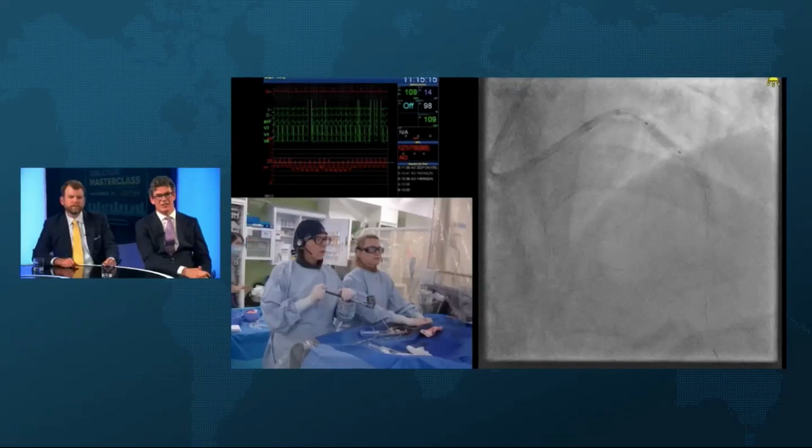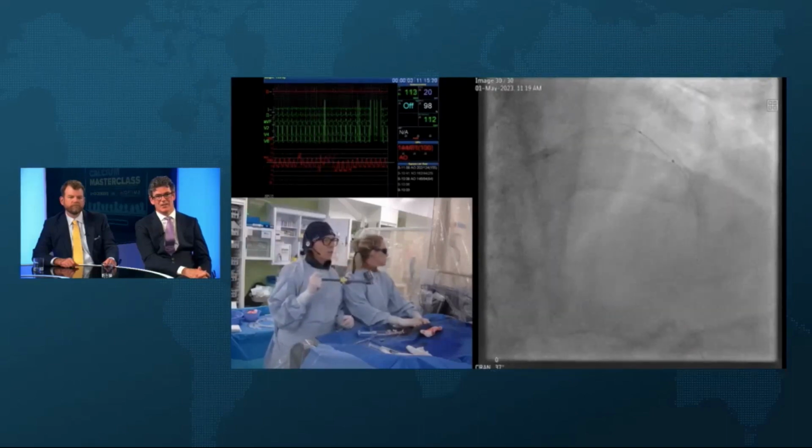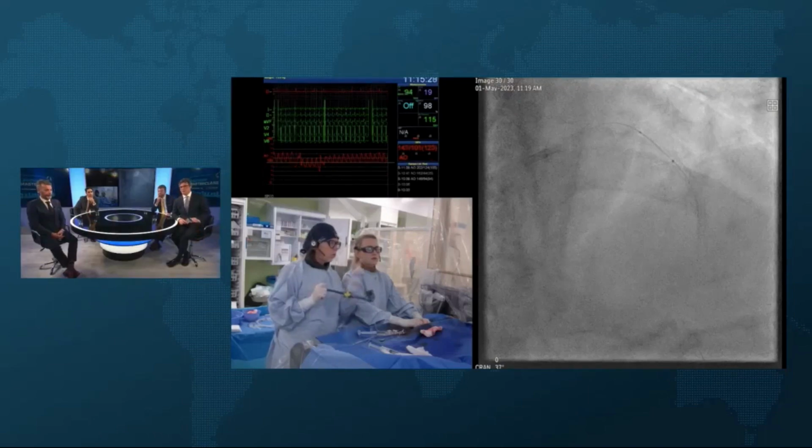Okay, so that's a 15, so I think you're just touching the other stent there, Claudia, aren't you? Yeah, so there's no way it's 48, Margaret. So it's probably not. It's maybe 38. That's a great point. I think 38 is a great idea. Based on your previous IVUS, why don't you IVUS and just show us?